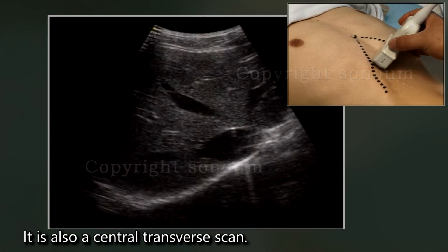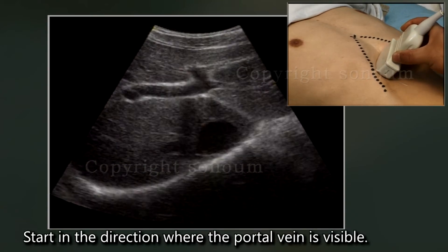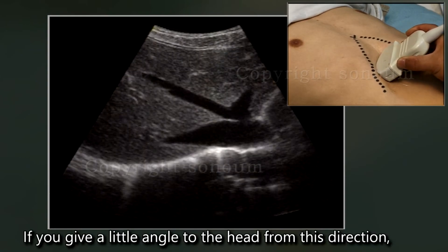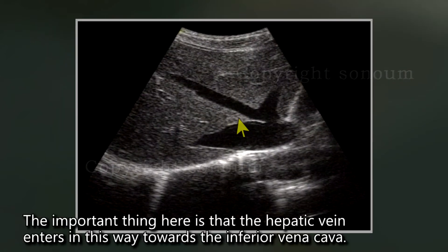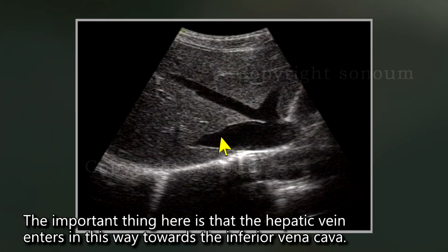Let's practice based on what we have learned so far. It is also a central transverse scan — inspect in the same way. Start in the direction where the portal vein is visible. If you give a little angle toward the head from this direction, the hepatic vein appears as three branches. The important thing here is that the hepatic vein enters towards the inferior vena cava.